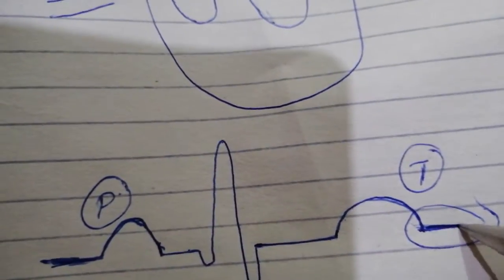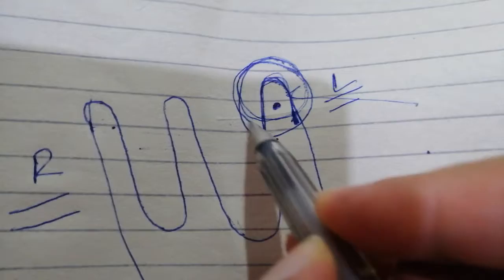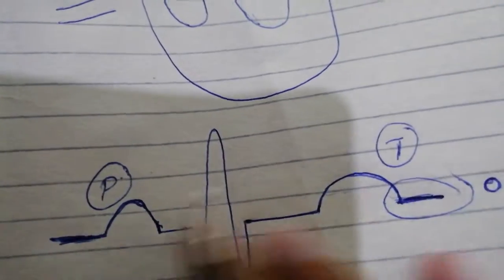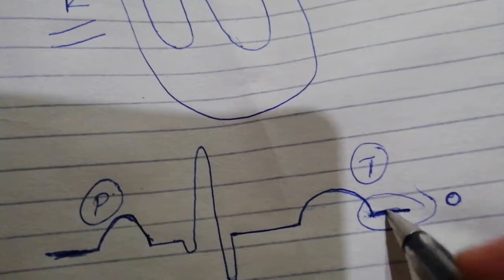Return to baseline level will not happen at the TP segment, because there will be one part that will always be depolarized. It will always be sending out a vector, so baseline will not be achieved. Now this is a bit difficult to tell if there is an elevation at this point or not, which would be a current of injury.